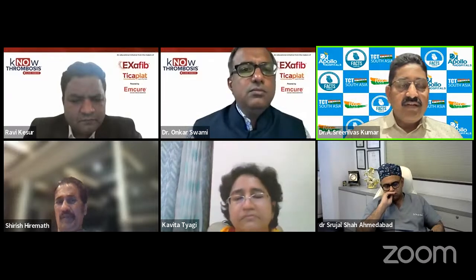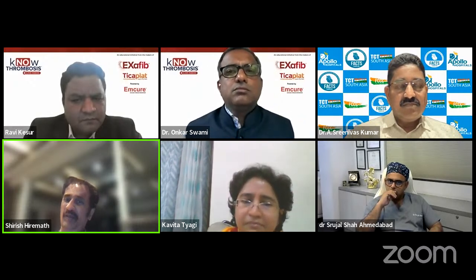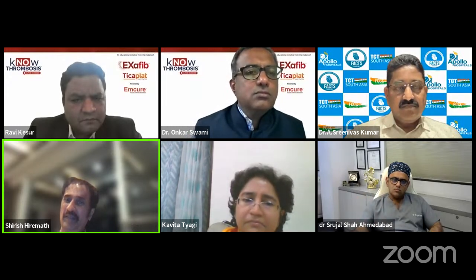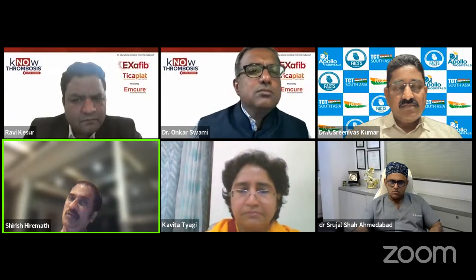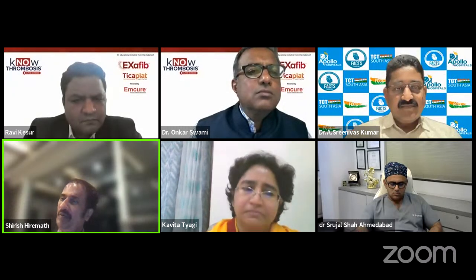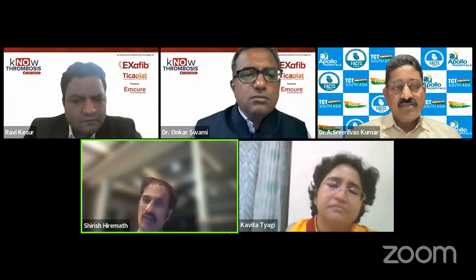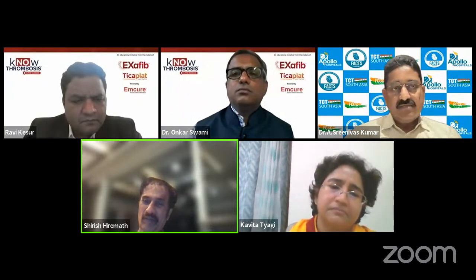Sir, you are telling something, sir? Yeah. I was also thinking that if you do the difficult vessel first, the material that you're opening up is getting into the more complex or more difficult vessel. And the same can be used on the simpler lesion in the other vessel. So I would probably feel that in terms of hardware also, you save a lot if you do the more difficult vessel first and then go to the next one.